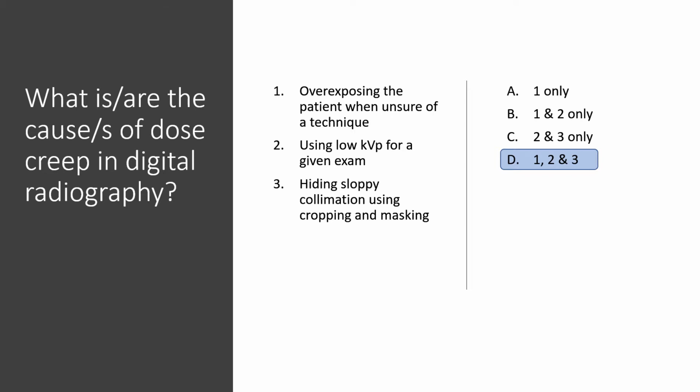While "when in doubt, burn them out" has been quietly practiced in imaging departments across the country, it is an excuse used by incompetent practitioners. We have seen digital systems fix or correct grossly overexposed images. Next, many radiographers use lower kV and higher mAs techniques, with the mistaken notion that it will enhance contrast.